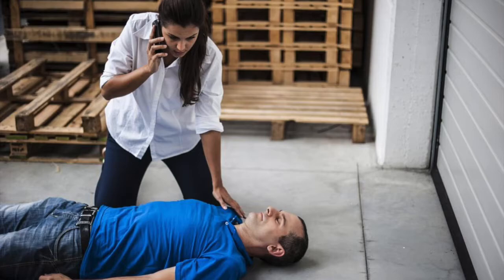Once the person starts to show signs of consciousness, you're going to want to explain to them the situation that has just occurred. Explain that they were experiencing an overdose, that you've administered naloxone, and that 911 personnel are on their way. Make sure to stay with the person until emergency personnel arrive. Do not leave the person alone.